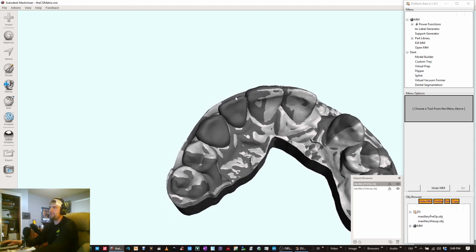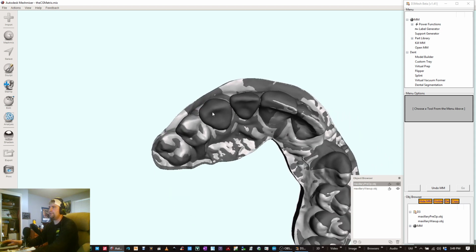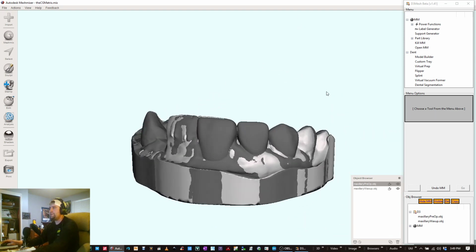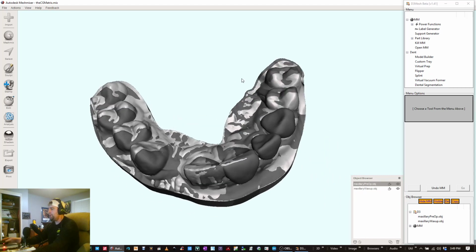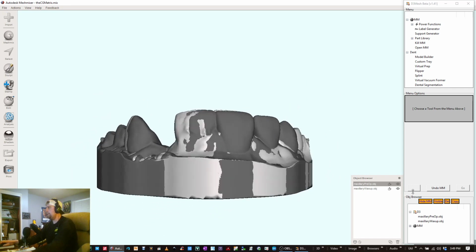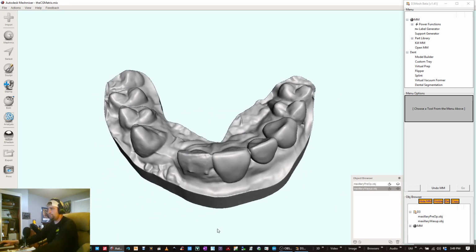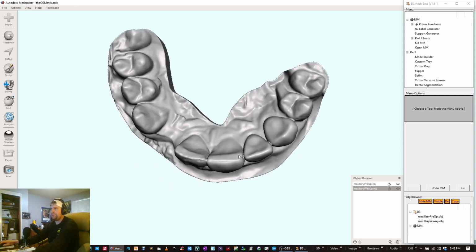Here and here on these 2 teeth, yeah, I'm going to have to do some adjusting, and I didn't factor that in. I didn't grind any occlusion from the lower dentition in. It's just mainly for a wax up here, and then once it's in, I can clinically get the occlusion appropriate. So that's what that is. But pre-op, wax up, get that done. And it was just kind of cool that you can use that tool too.